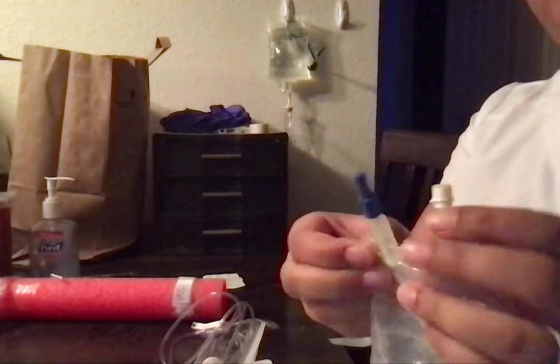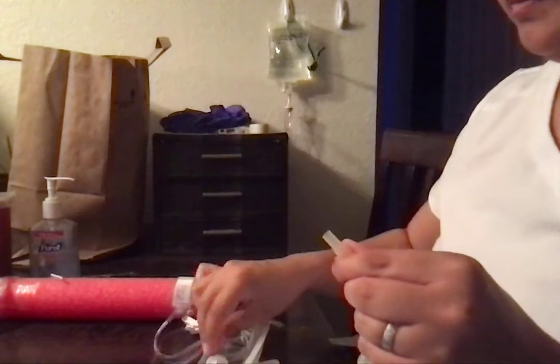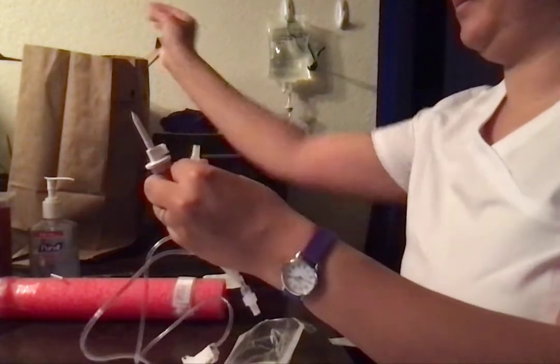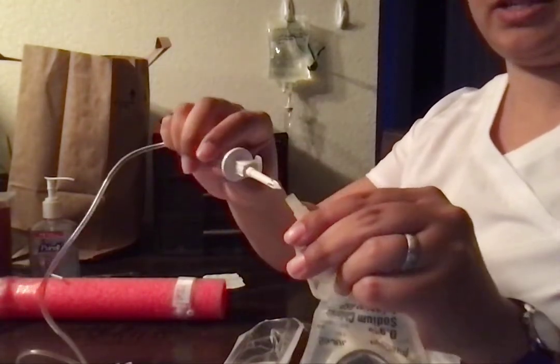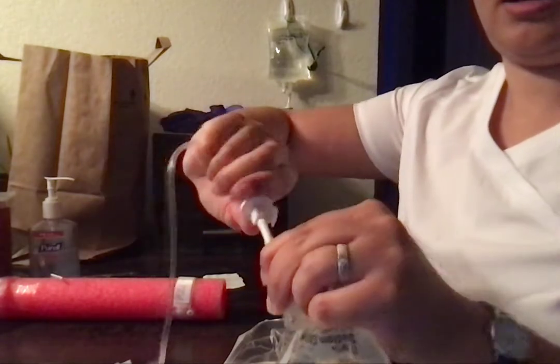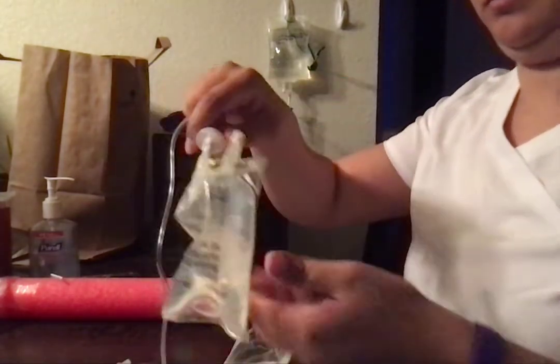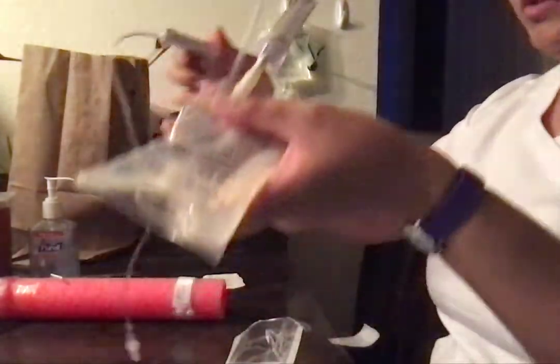Okay, so we've got to make sure that we don't touch the end there. Look at the fluid, all looks good. Making sure to not touch anything except for what needs to be touched. That goes inside. Before I invert it, make sure that's closed.